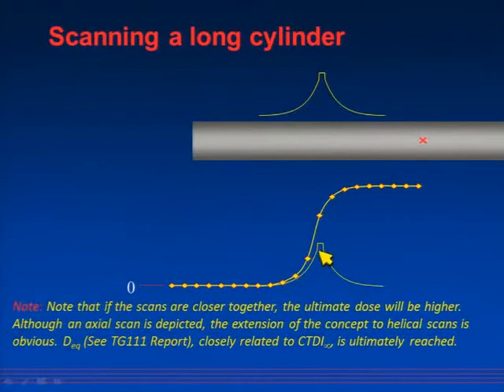Now, notice here that the cumulative dose that this thing picks up is substantially larger than it would have received had it just been sitting in the middle of the beam. All of this scatter adds a considerable amount of dose to the patient. The scatter isn't good for anything either.